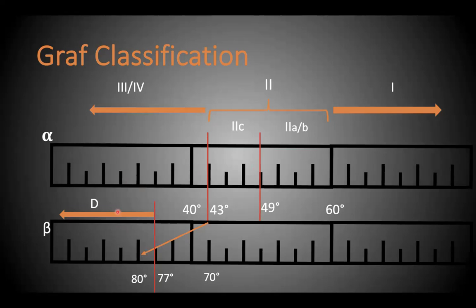And the management varies for the type D hip, right? That you'll be speaking about in the later slides. So the management, again, would not vary for a 2C or a D hip, you would want to treat them. But again, now we are doing this RCT wherein we are trying to study the outcomes of 2C, we are randomizing them into two groups. So 2C also is a part of our RCT. But classically, if you look at Graf's treatment protocol, he would treat all 2C hips. Okay.